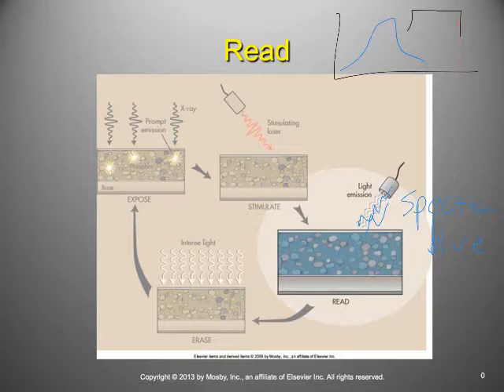And the reason why this gap is important is because we're trying to sample light, right? That's the way that we're reading this thing, we're sampling light. So it would not work if I'm sampling red as well as blue. I wouldn't get anything. I'd get a very weird looking picture. So I'm only going to sample the blue. I'm going to have a laser that's scanning across it that's red, but then the computer only wants to look at the blue light.